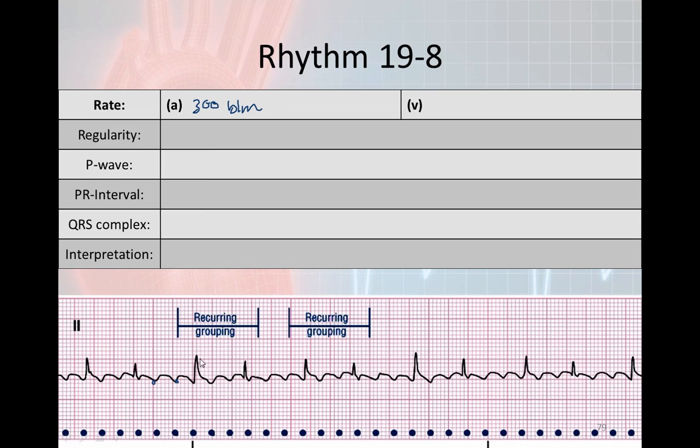The ventricular rate is variable. So what is the widest ventricular rate we have here? That looks pretty wide, R to R. So 300, 150, 100. So it looks to be about 100 beats per minute. To, what is our narrowest R to R interval? That looks like it. 300, 150. So that's about 140. Let me see here. 300, 150, 100. So maybe 140. So you have a discrepancy there of about 40 beats a minute, and I'm estimating here.